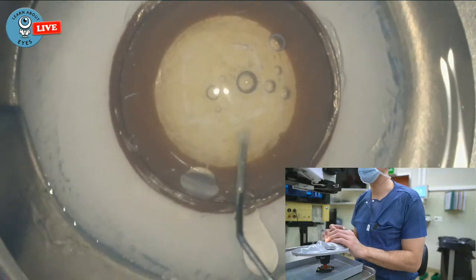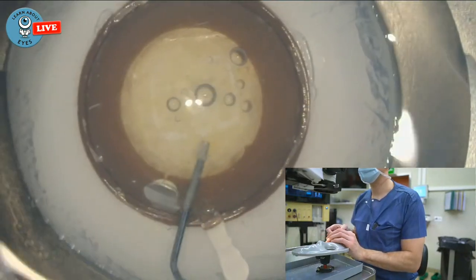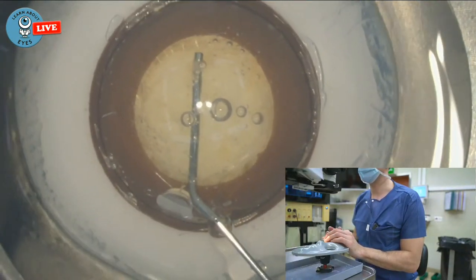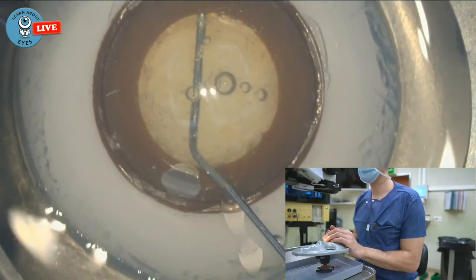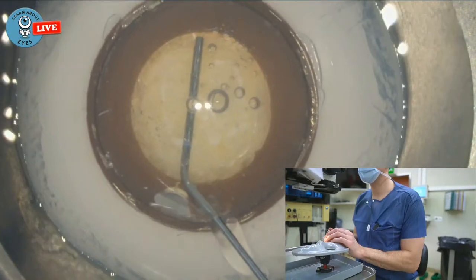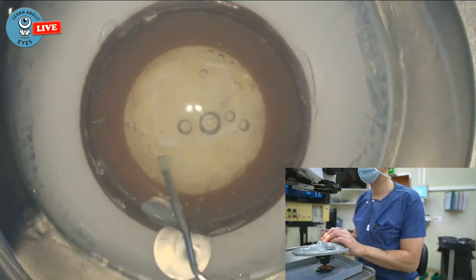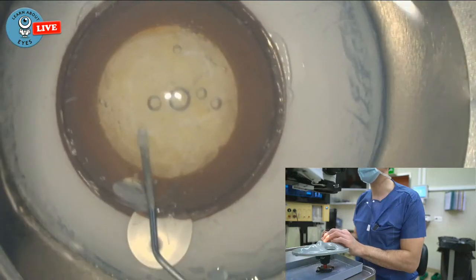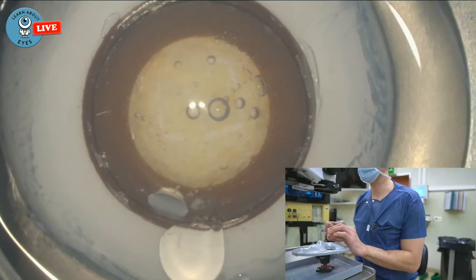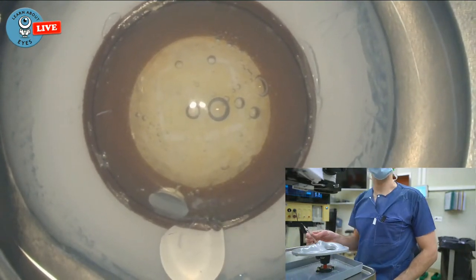But I just try and rotate them afterwards. What you shouldn't do is what I just did, to go too much into that wax. Just need to kind of lift it up. There we go. Push it a bit. And now it rotates. As the guy from Cataract Coach, Uday, always says, if you can't spin, you can't win. I don't know.